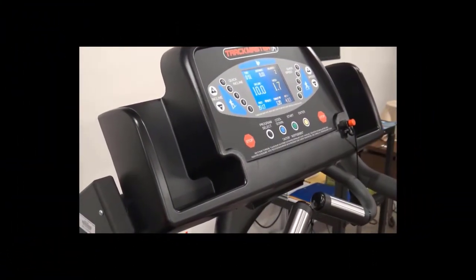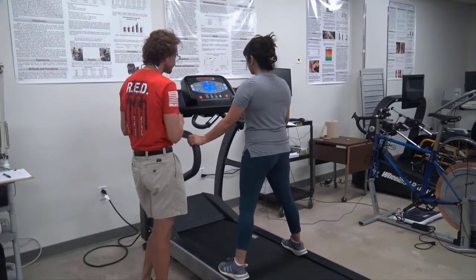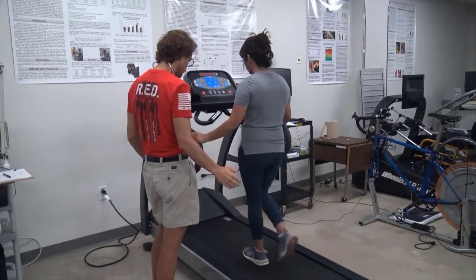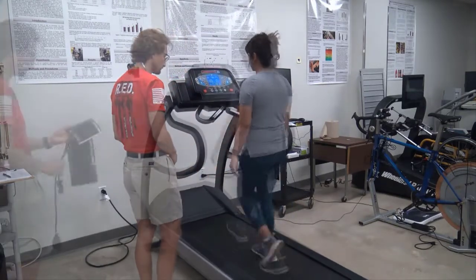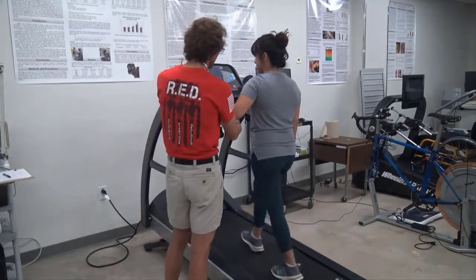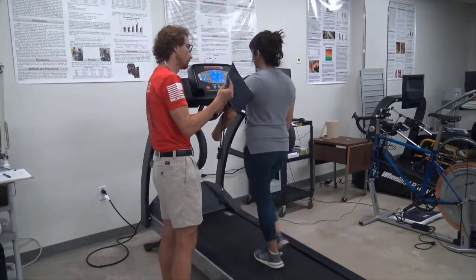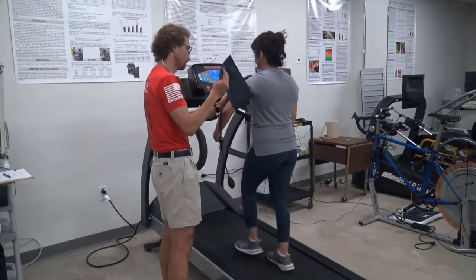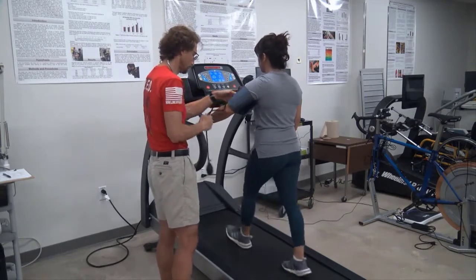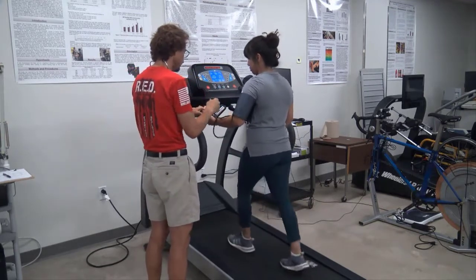The first stage of the Bruce single-stage submaximal protocol begins at 1.7 miles per hour at a 10% grade. Be sure to watch your client as they begin to walk and ask them to let go of the rails once they are comfortable. If you have not yet placed the blood pressure cuff on the client's arm, now is an acceptable time to do that. When fitting the cuff, be sure to remember the points brought up in the blood pressure tutorial. The client can hold the bulb while walking, and you can clip the gauge to the sleeve or to the cuff itself.